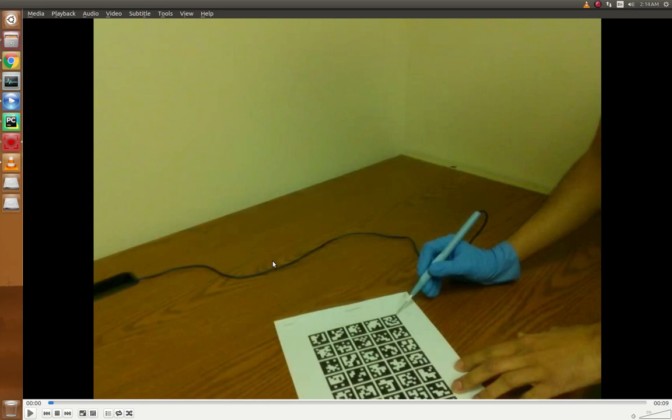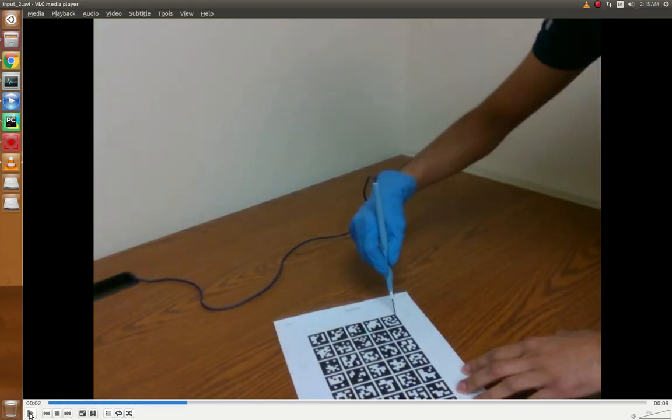Okay, so in this experiment I'm trying to validate how accurately I can estimate the tip location of this pen I'm holding. For estimating this tip I'm using DOPE, the Deep Object Pose Estimator, and for the ground truth location of the tip I'm using this aruco-board, and this is how my videos look like. I rotate my pen surrounding this point. Why? I will explain it right now.